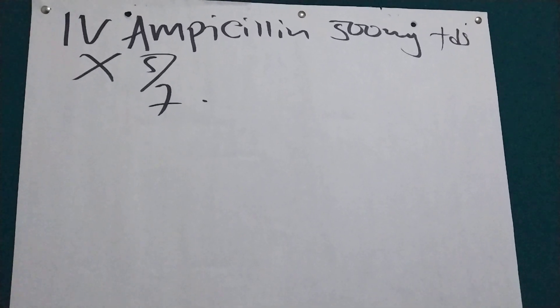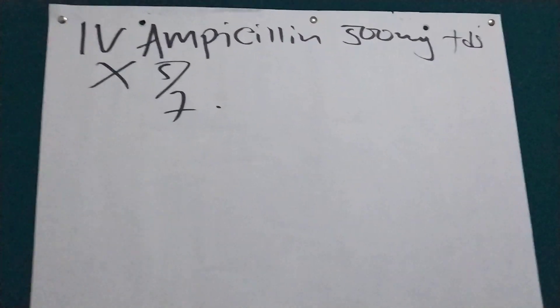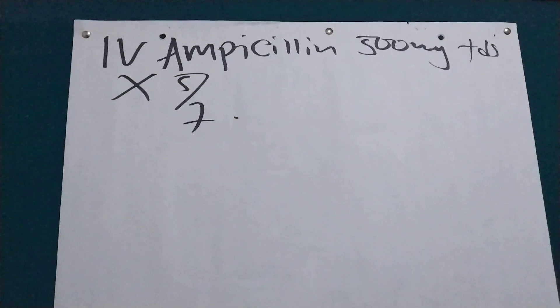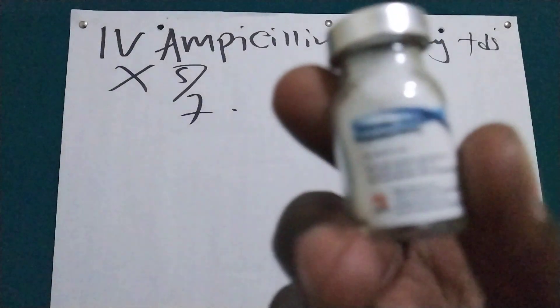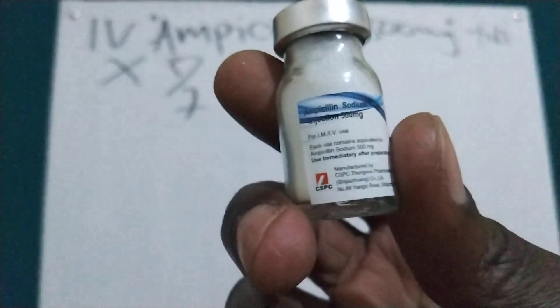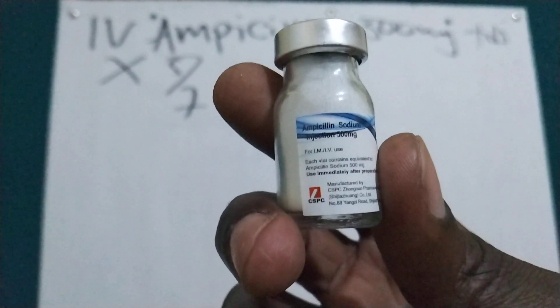So we are going to dilute the one which is having 500 milligrams of the vial. As you can see from here, this is ampicillin 500 milligram.